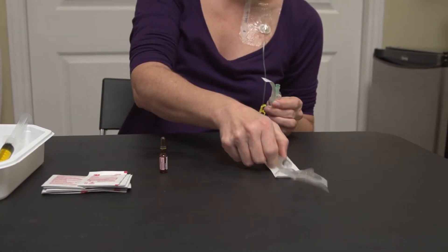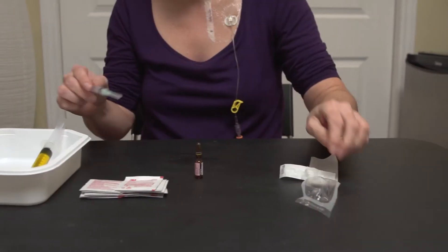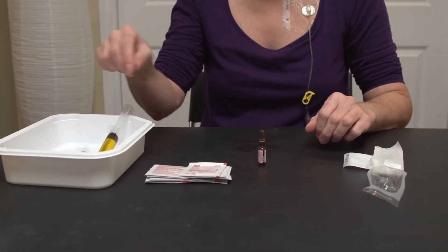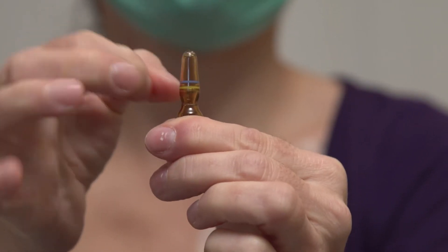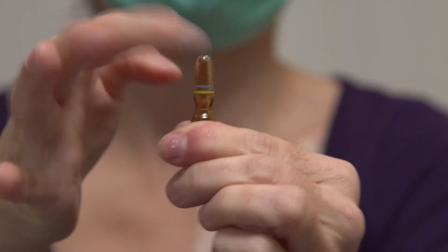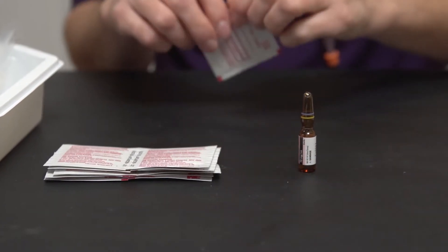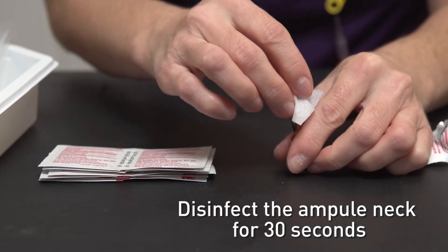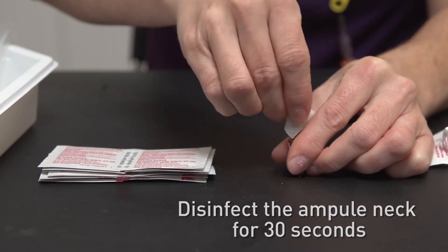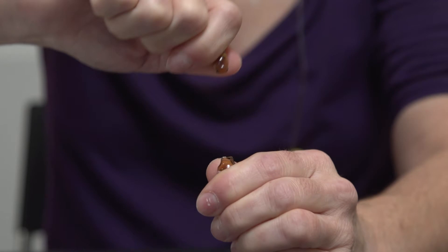Remove the needle from its package without touching the tip and screw it into the syringe. Put the syringe down. Tap the top of the ampoule to make sure all of the medication is in the bottom part. Disinfect the ampoule neck with an alcohol wipe for 30 seconds.